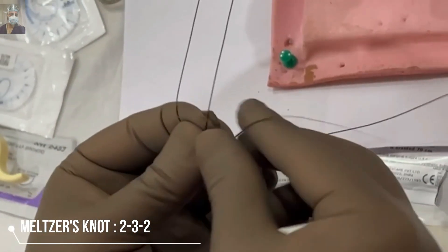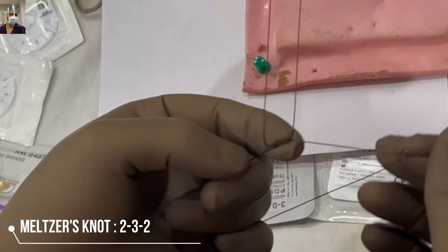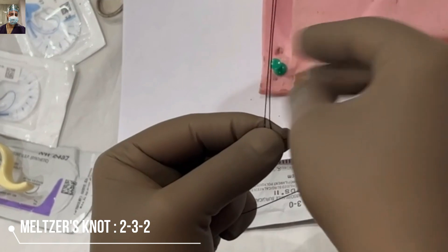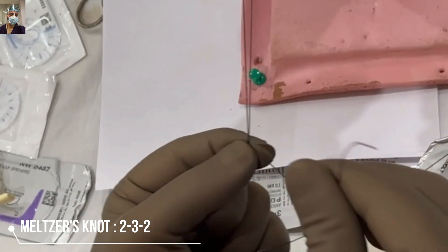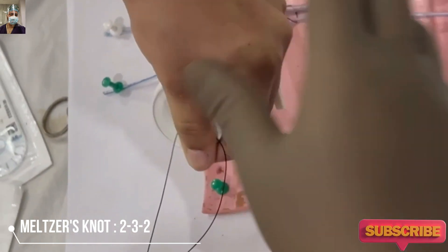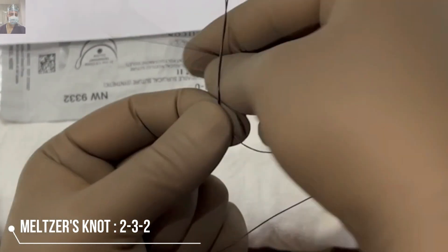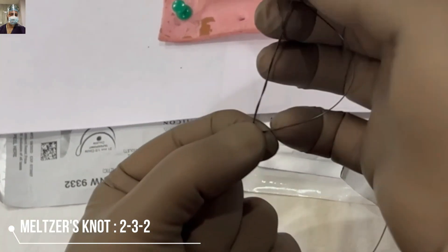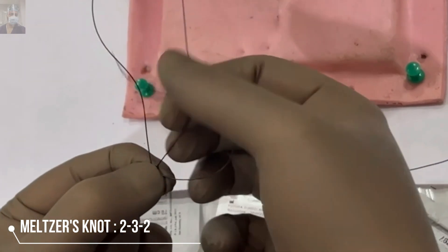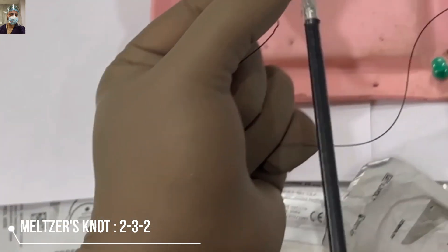The process will be 2-3-2. Keep a steady left hand — all movements have to be done by the right hand. Then take three binds and stack them properly. Stacking properly means the first, second, and third binds should come sequentially; they should not overlap. Keep these binds firmly between your index finger and thumb. Then take a lock, don't tighten it too much, and then start sliding — you can tighten it further. Stack them properly and it will hold beautifully.